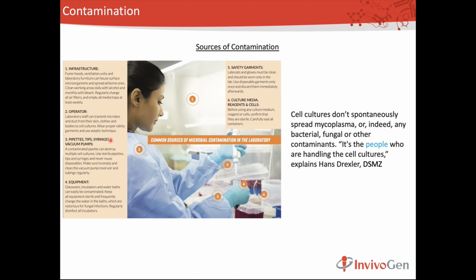Same thing for pipettes and tips. You always autoclave, or use the already packed, sterilized pipette tip boxes when you work with cell culture. So these two are not likely.